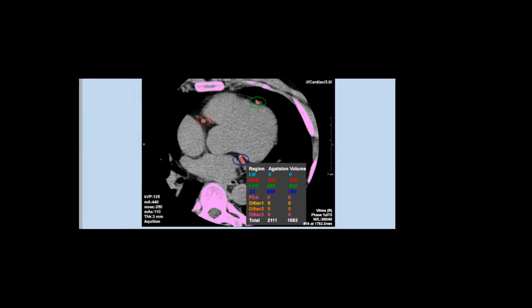So if you don't have any risk factor but you have a calcium score, bad. This is very bad. If you have so many conventional risk factors and zero calcium score, very good news. So calcium score can modify the risk factors. Okay. So it's advocated as a screening test. Now the calcium score is basically, are you going to use contrast or non-contrast CT?